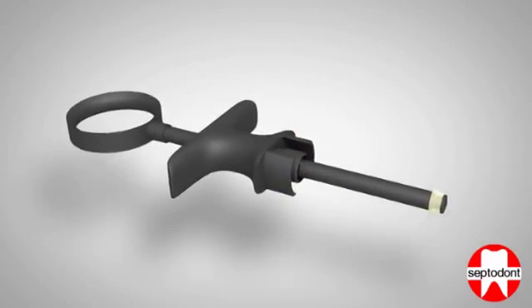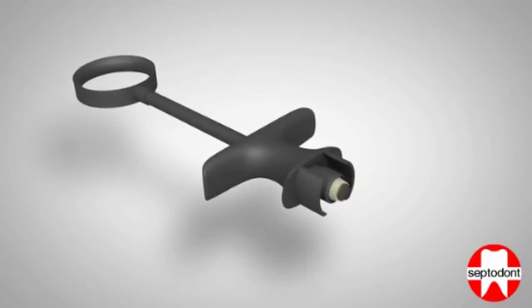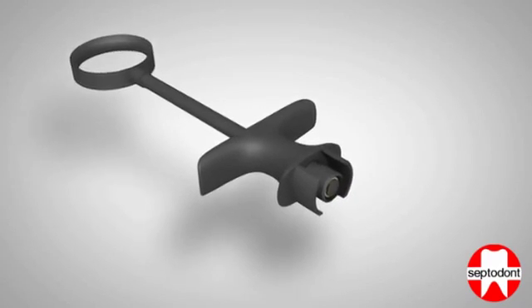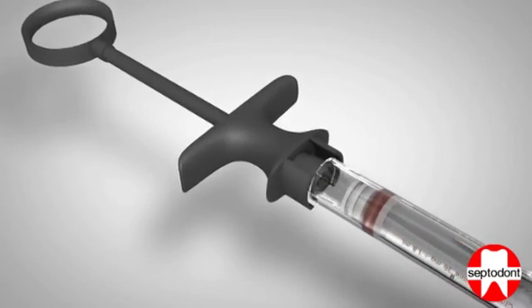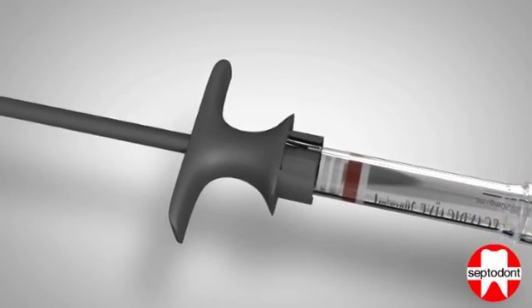Step 2. Slide the finger grip to the end of the plunger, making sure it completely covers the silicone tip. Insert the handle into the open end of the syringe directly behind the cartridge.